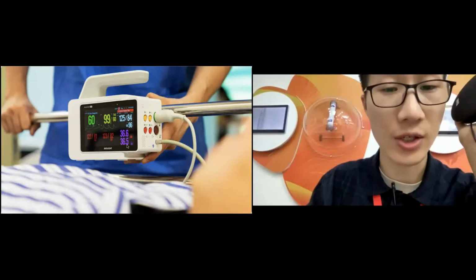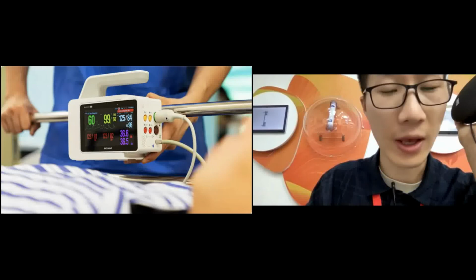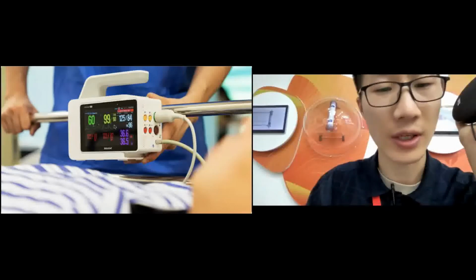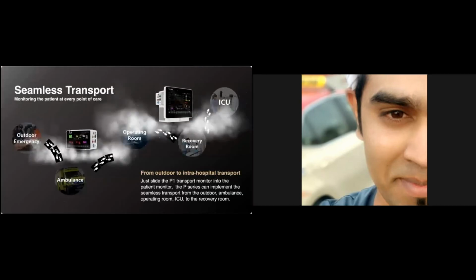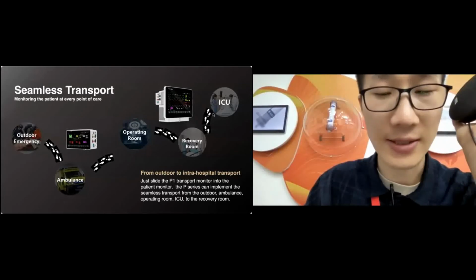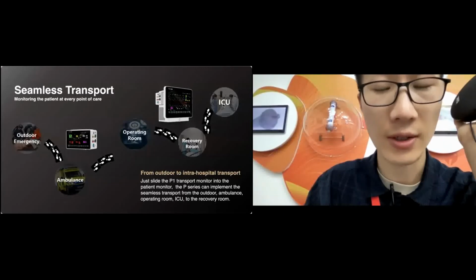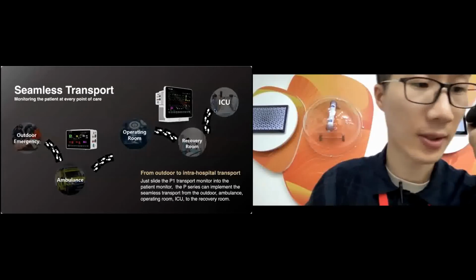When we have this docking station, we'll be able to connect to an external display. Then we can operate on this P1, but not on external displays or medical grade displays. If we need a bigger screen, we insert this P1 into the main unit, and we'll be able to operate on the main unit. Because this main unit does not have any modules, if we don't put any module inside, we can't operate this monitor. So this P series main unit requires a module, such as the P1, to be inserted inside to operate.